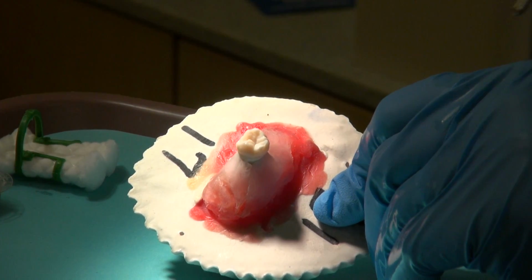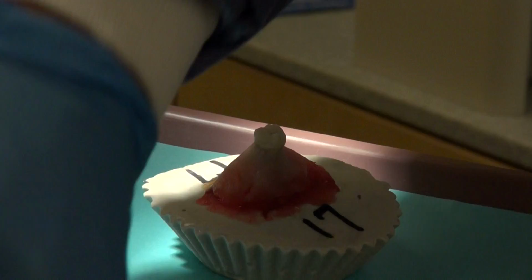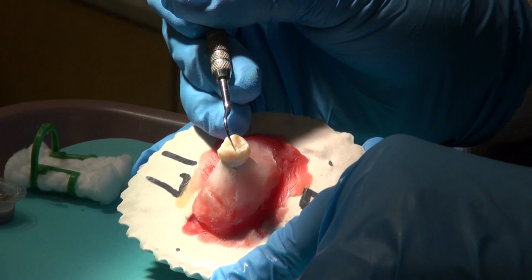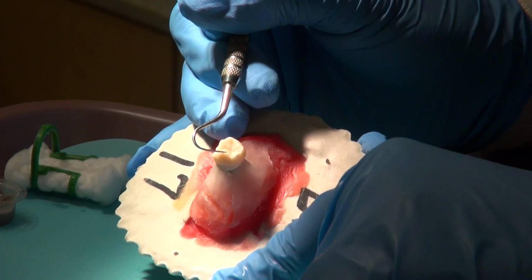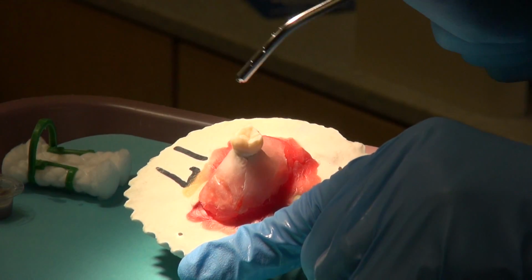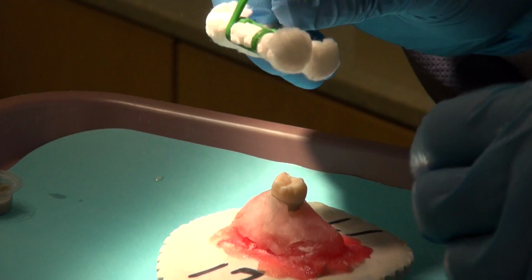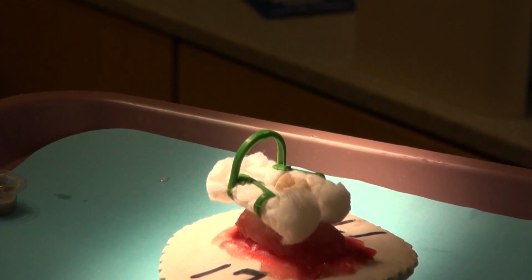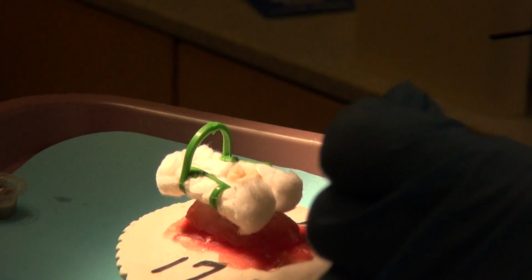We want to make sure that that acid etch went down into those grooves and etched inside the ridges, because that's where we want our sealant to flow. It's not important up here. We don't want sealant up here at all. So we're just going to take a nice little air stream and dry, and that looks really good. Take our new cotton roll holder with clean, dry cotton rolls, isolate the tooth again, and now we're prepared and we're ready to place our sealant.